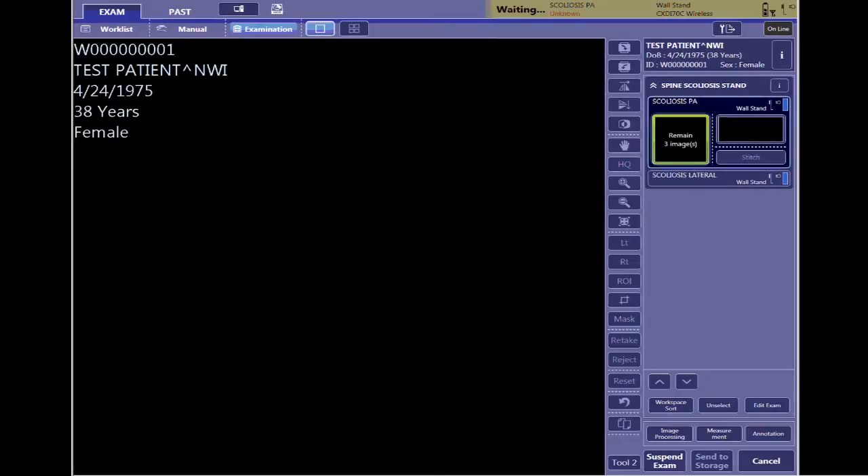You should see a box that will tell you how many images the computer is expecting. What we'll have you do is go ahead and start with a three-image stitch. If you only use the first two images, that's fine — you can stitch after that. If you do need the third one, it will be there and ready for you.